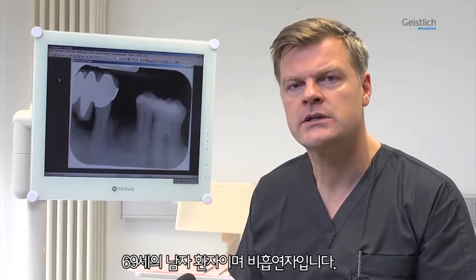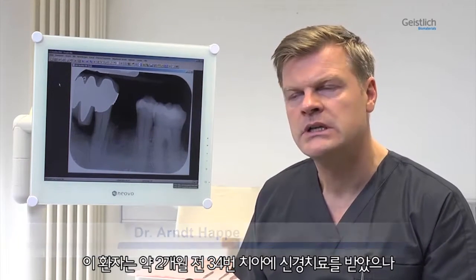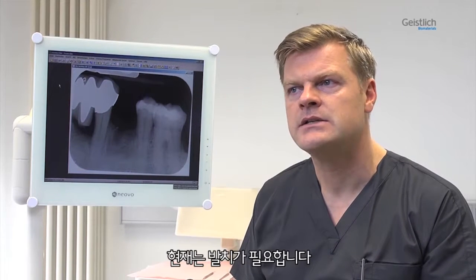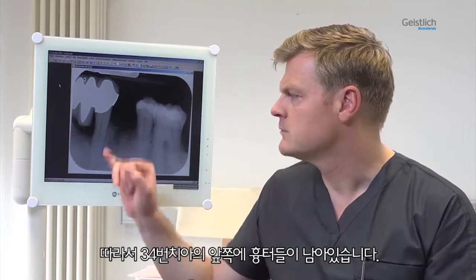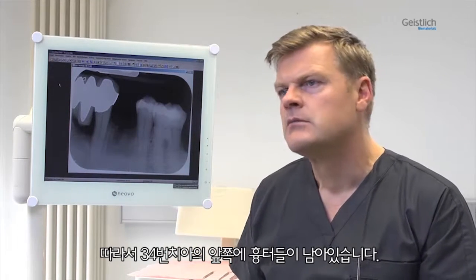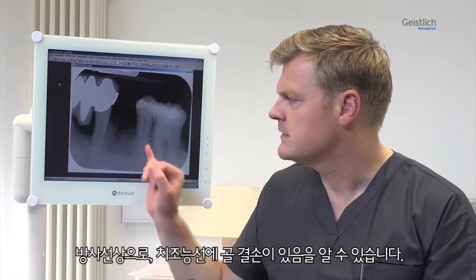The patient is a healthy 69-year-old man and a non-smoker. 2 months before the present intervention, tooth 3-4, which had been endodontically treated in the past, needed to be extracted. In the course of this treatment, the apical tip of the tooth was resected. Site 3-4 therefore exhibited corresponding scars on the vestibular side. A moderate alveolar ridge defect is recognizable in the radiograph.